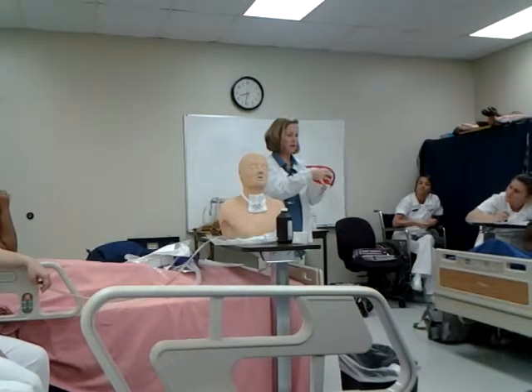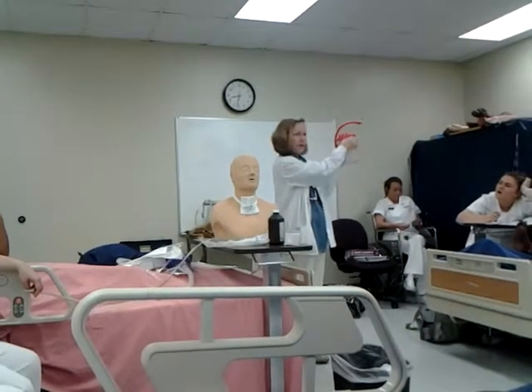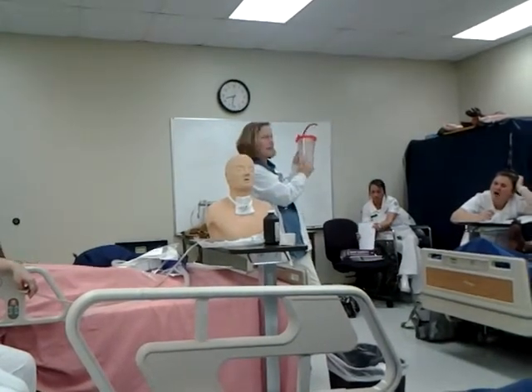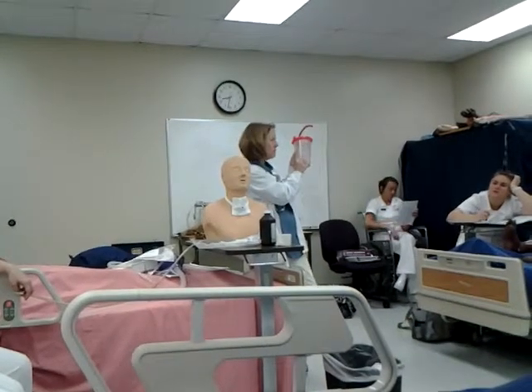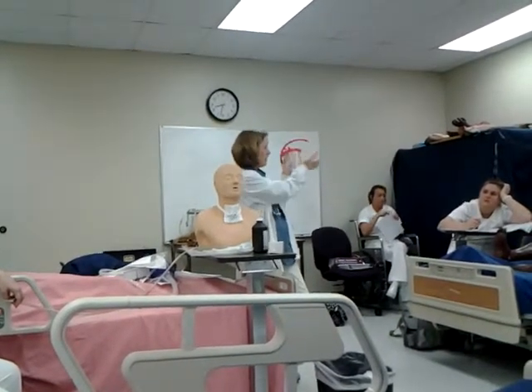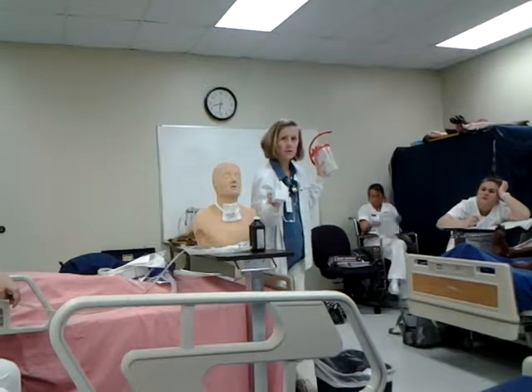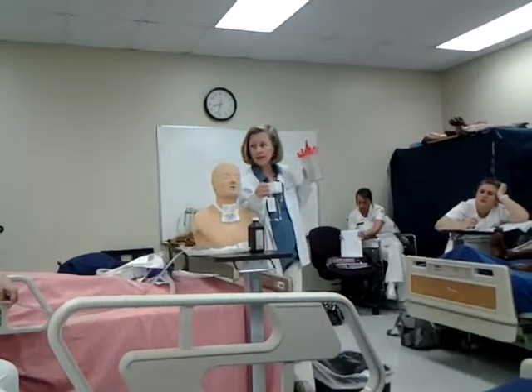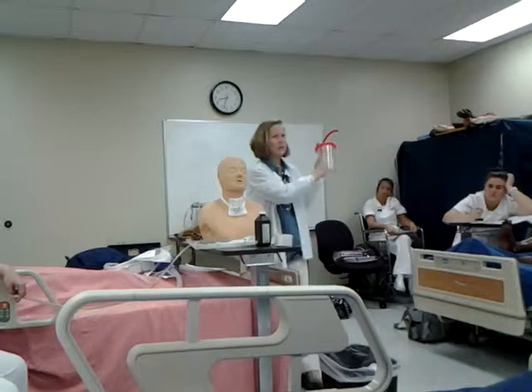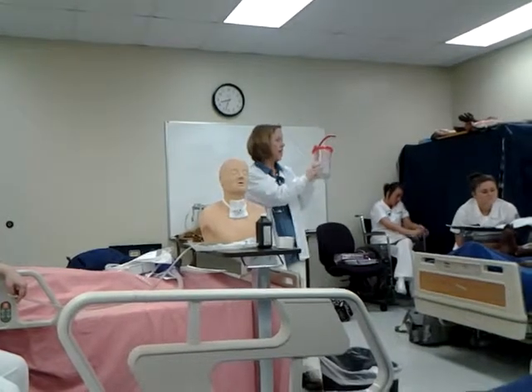How would you do that, Jada? Is it measured on the side? It does have measurements, and you can take a piece of tape and put it vertically on here and say at the end of the Jada shift, it was at 175, and you can mark on the tape. So that when Lauren comes in and hers is at 220, then she can just subtract and make the difference. So we have to account for this as well. So this has to become intake, right, and then output. So our output, everything in here is not going to be secretions from the lung, right? It's going to be secretions from the patient and our saline.